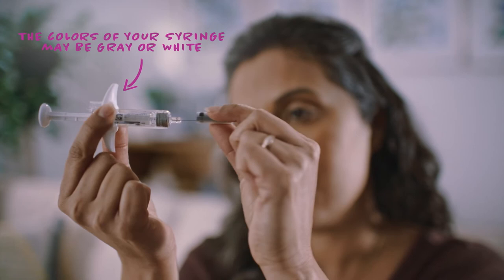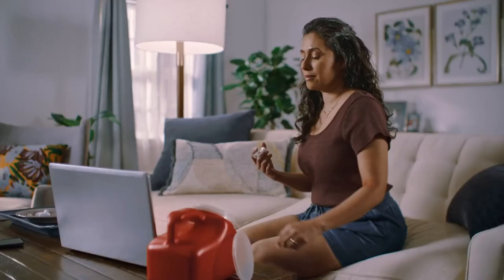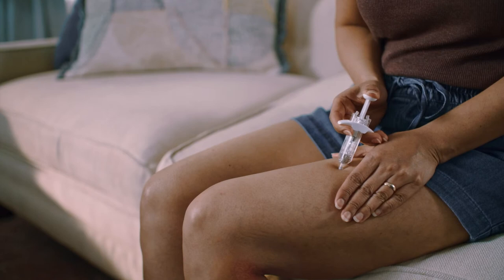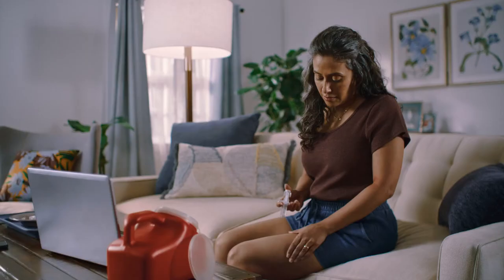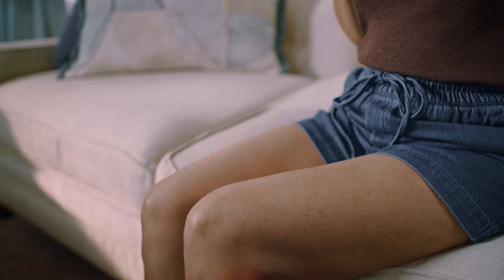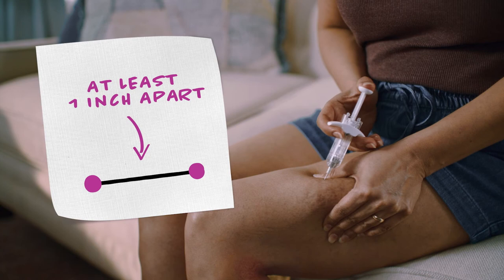When you're ready to inject, carefully remove the needle cover while making sure not to bend the needle. You might see a drop of liquid at the end of the needle — this is normal. Throw the cover away in a sharps container and never recap the ADBRI syringes after you've opened them. Don't touch the needle or let it touch any surfaces. With one hand, pinch and hold a fold of skin that you cleaned. With the other hand, insert the needle completely at about a 45-degree angle into your skin. Use your thumb to inject the medicine — push down on the plunger head until you can't push it down any longer. Now lift your thumb off the plunger head. The needle will automatically move back inside the syringe and lock into place. Take the used syringe and put it in your sharps container. If needed, you can place a dry cotton ball in the area for a few seconds or cover it with a small bandage, as there may be a small amount of blood or liquid where you injected — this is normal. Repeat this step, making sure it's at least one inch away from the previous injection site and within the same area of your body.